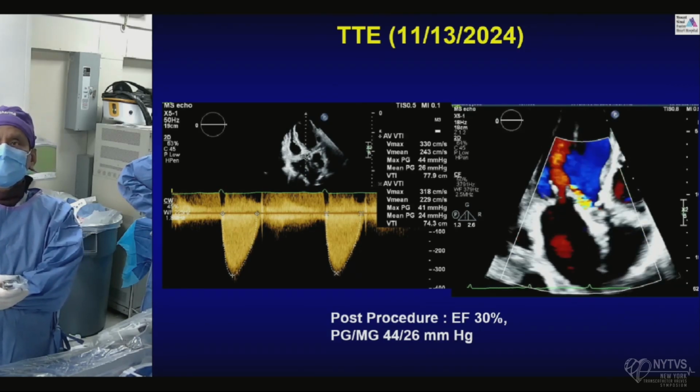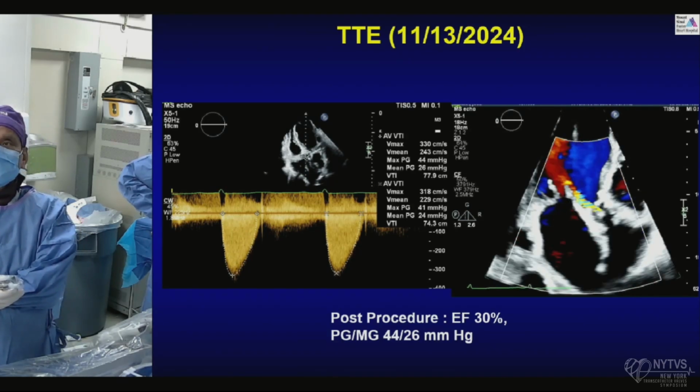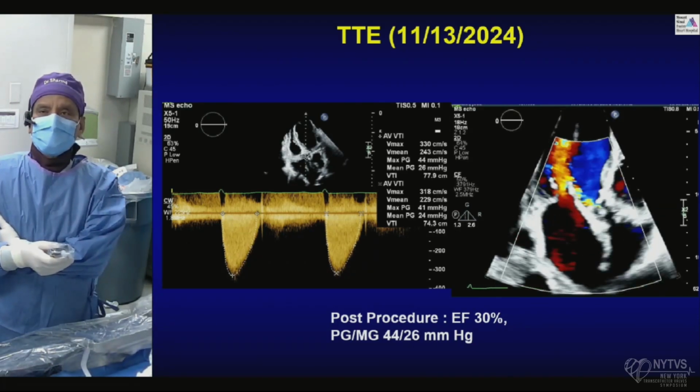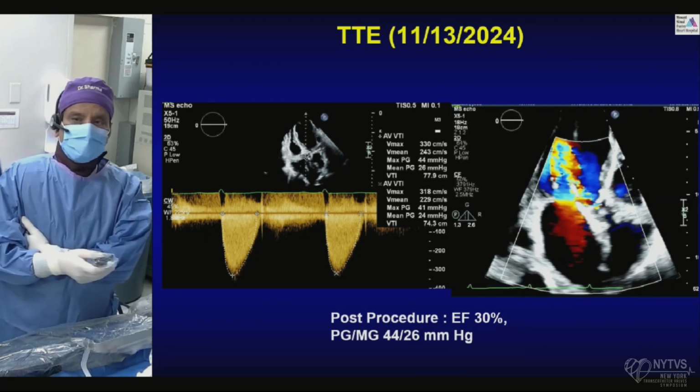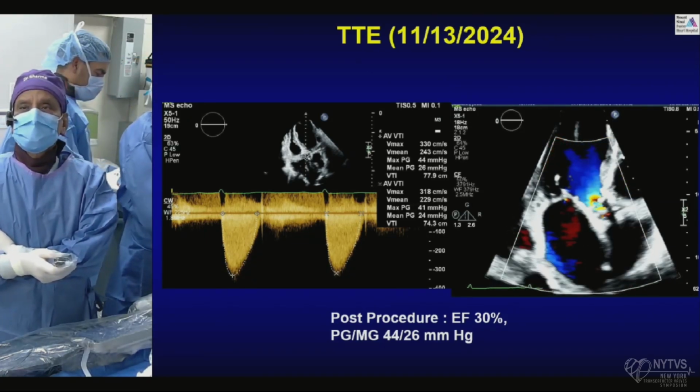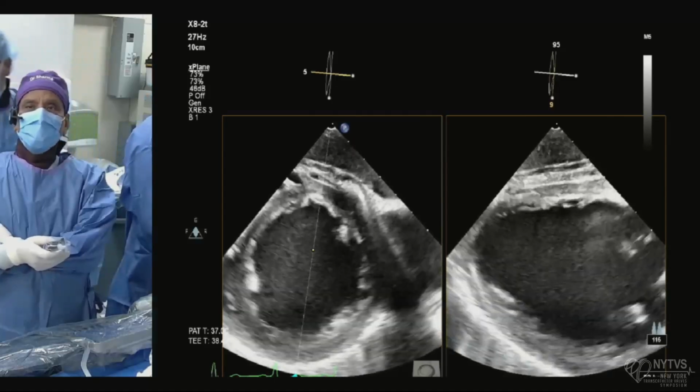Live echo. It's on? No, wait 1 second. Okay, live echo, please. Drop down. Sorry, okay.